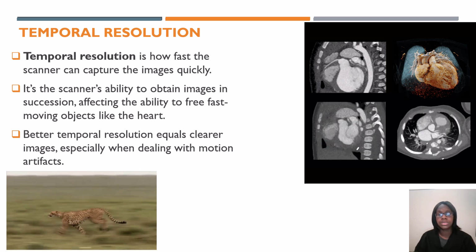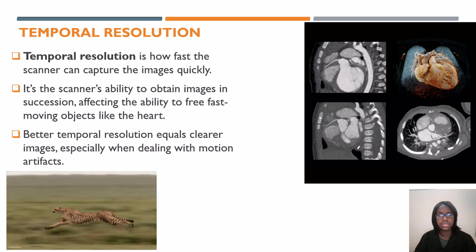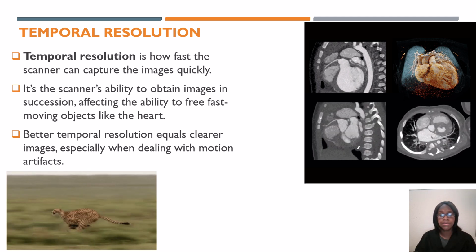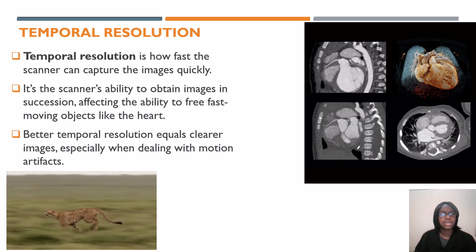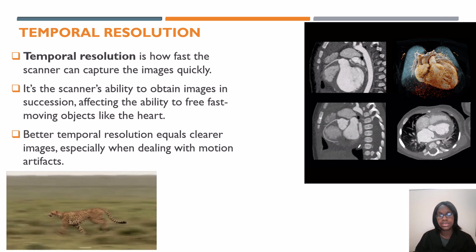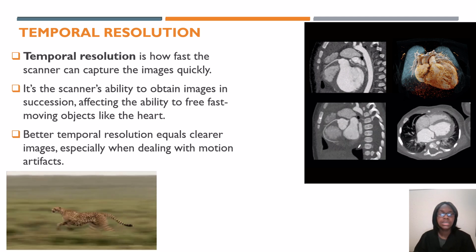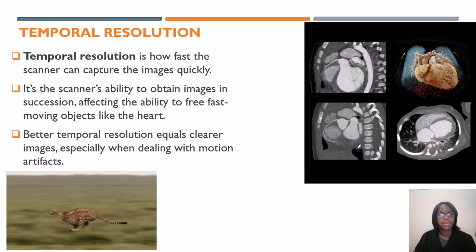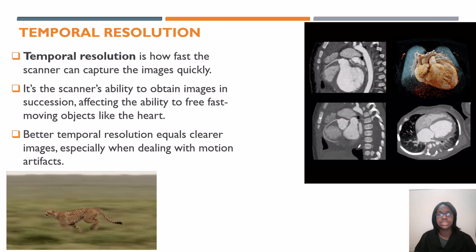It is very good for someone who you know cannot hold still. So if you have a patient who is altered or who is just nervous about the exam, some patients get CT and MRI scanners confused. So maybe they just have anxiety about, is this an MRI? And you keep telling them, no, it's a CT scan. Sometimes they're still nervous because it looks very similar to them, especially if you don't work in imaging. So it's good for people who cannot hold still, who probably will move. This is what the temporal resolution is good for.